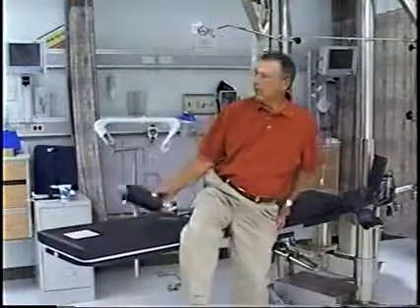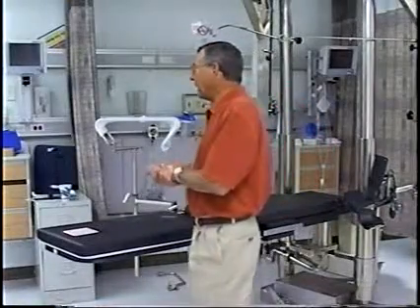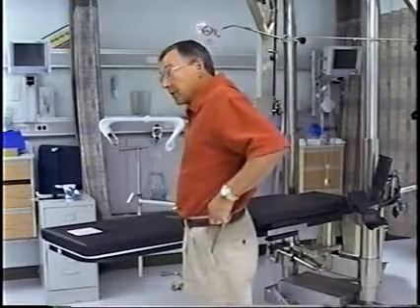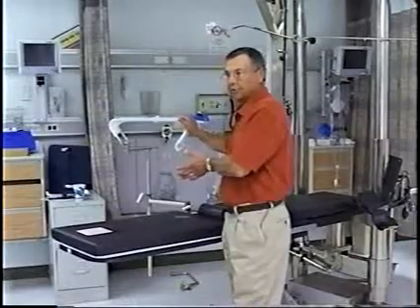You may see that happening more and more. I'm starting to see more of that happening. But just remember, if the doc says that he's going to do a hip arthroscopy, you really need to set the table up for bilateral traction.